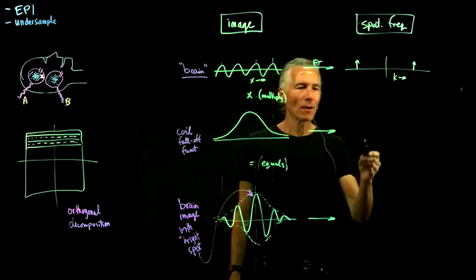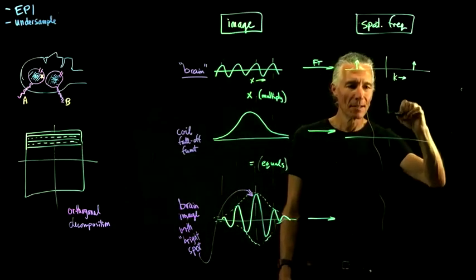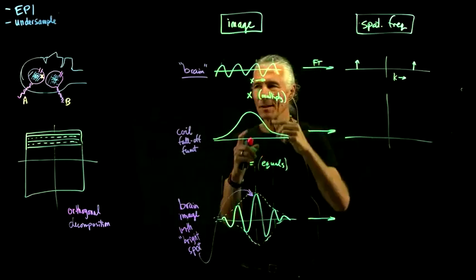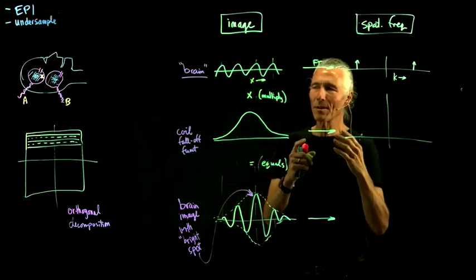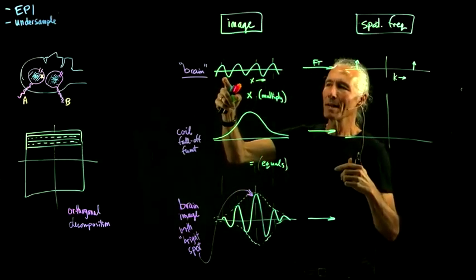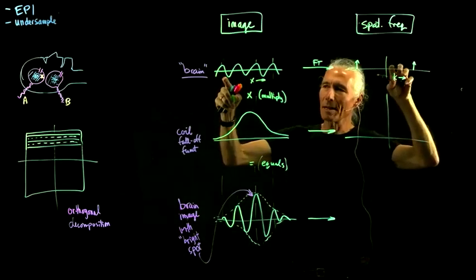And so first of all, what's the Fourier transform of a Gaussian? Well, it's basically a Gaussian, but remember that whenever you do the Fourier transform, each point in one domain maps to all the points in the other domain and vice versa.